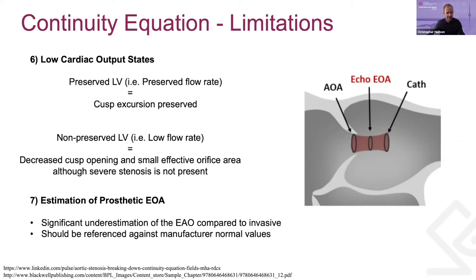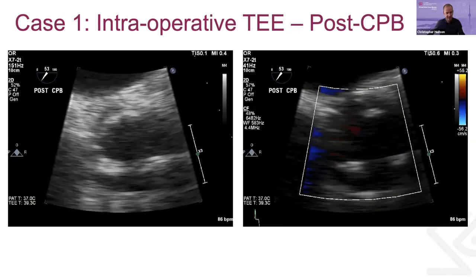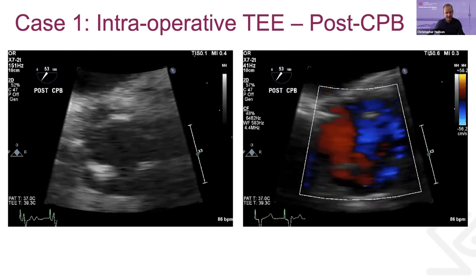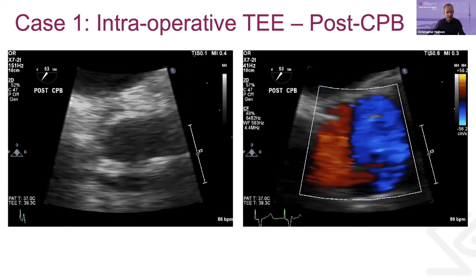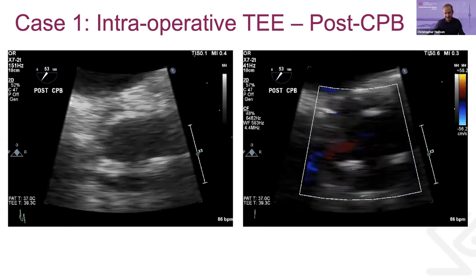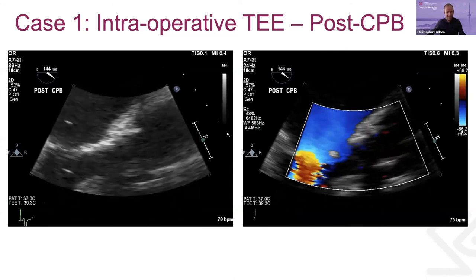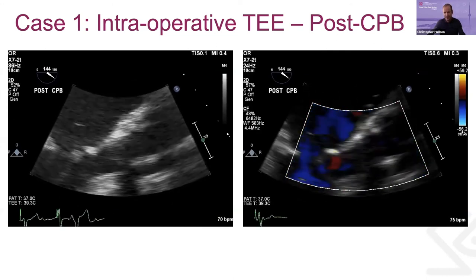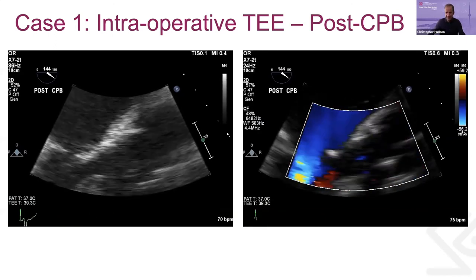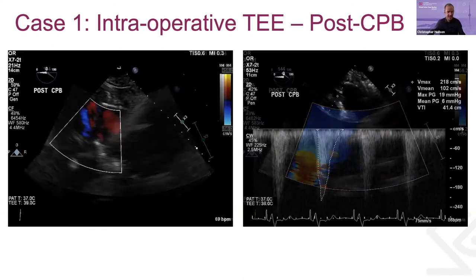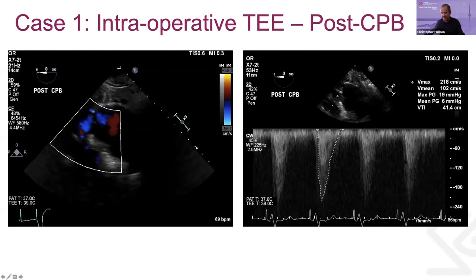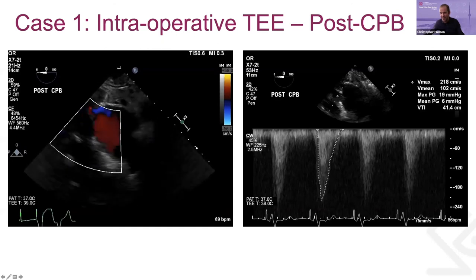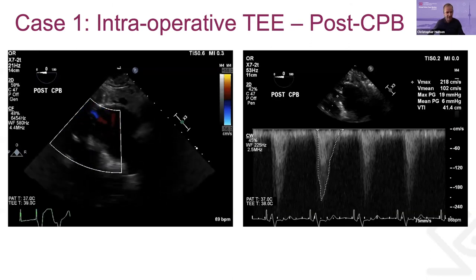Continuing with post-op images from case one. What you see here is a bioprosthetic valve. You're looking for rocking, making sure the valve is well seated, and looking for transvalvular and paravalvular leaks — all of which look normal. The long axis view shows the same: no leaks and the valve appears to be opening and closing well. The post-op gradient through the valve shows a normal gradient across the bioprosthetic valve.